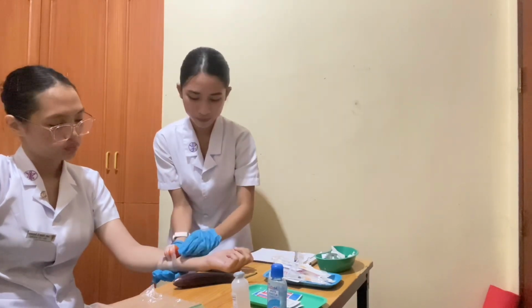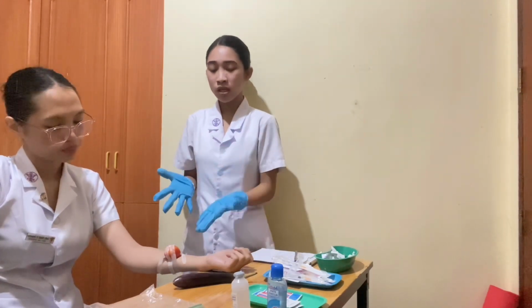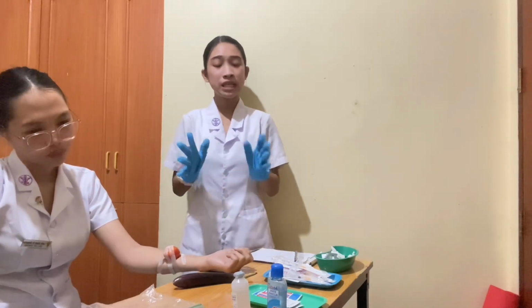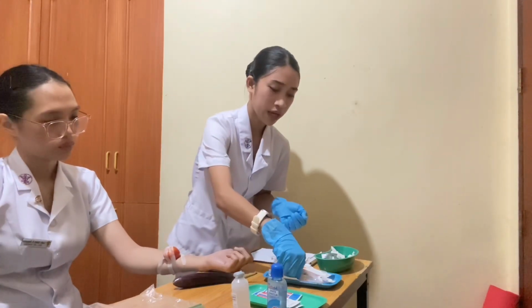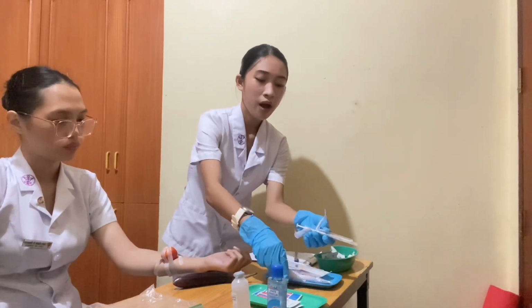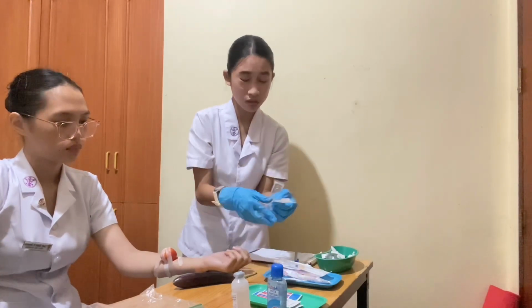Okay? Now, while waiting for the injection site to dry, I'm going to remove the needle cap, then remove the air bubbles from the syringe if there are any. Okay? Again, read the medication before and after withdrawing. So I'm just going to read. This is the sterile water for intradermal, 0.1 ml.